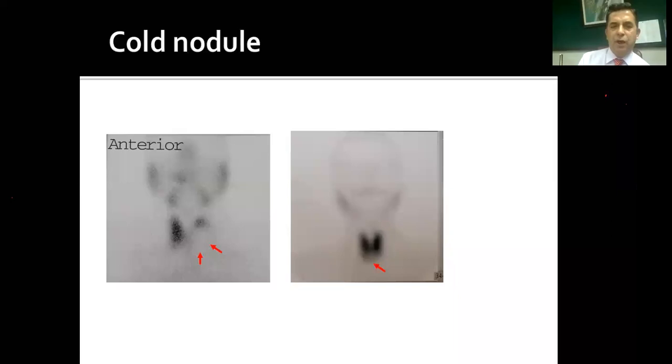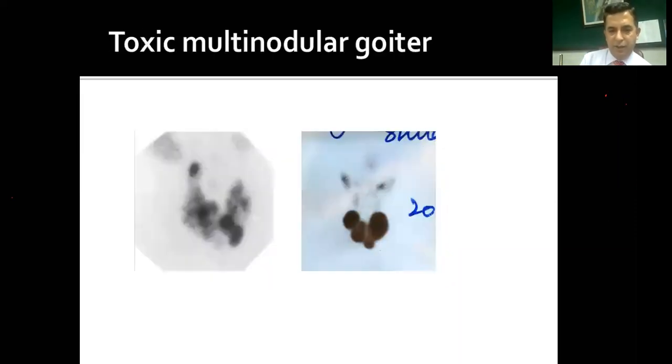But nowadays, we are not utilizing the thyroid scan in evaluation of the nodules, rather we utilize it for the evaluation of the function of a nodule. So I'll be telling you why we are doing scans in certain selected patients.